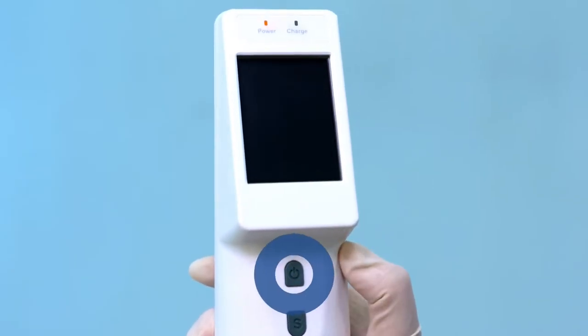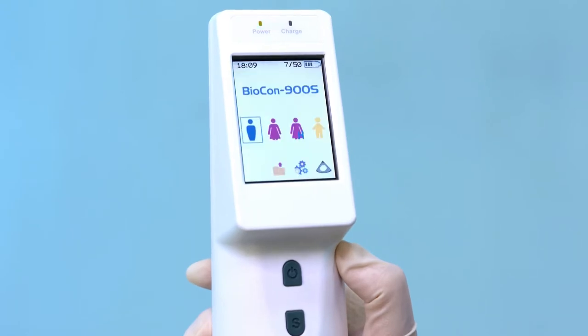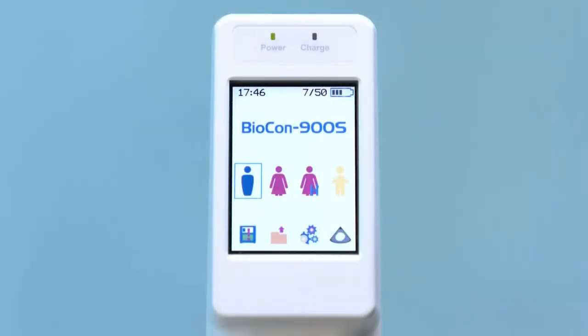First, press the power button until the screen turns on. Select the appropriate patient type. There are four types: male, female, female with hysterectomy, and child.